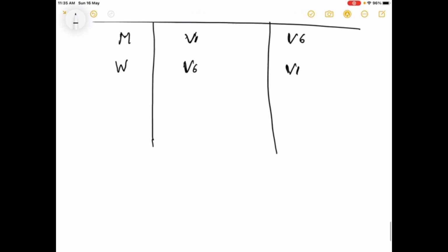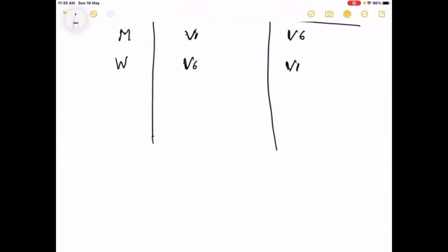Along with this, the left bundle branch block is usually associated with left axis deviation.